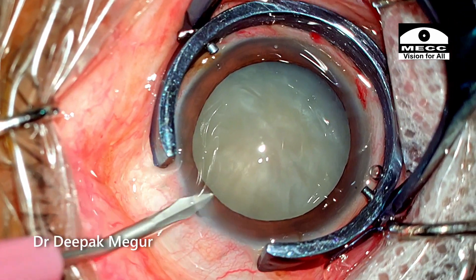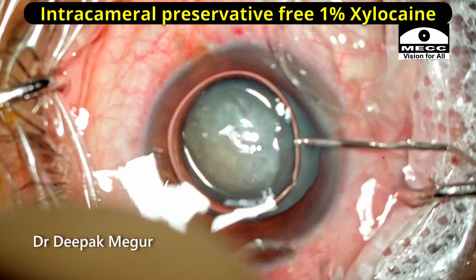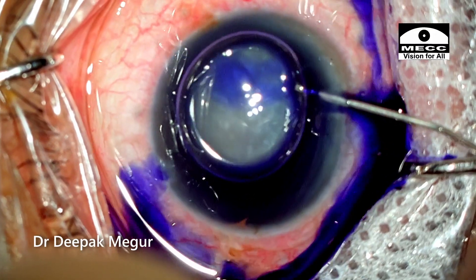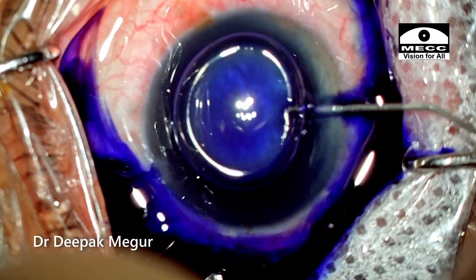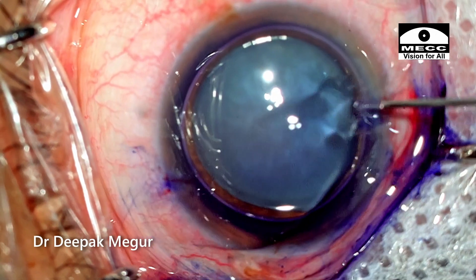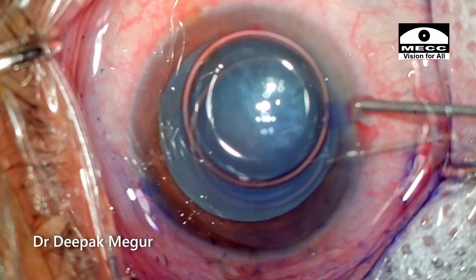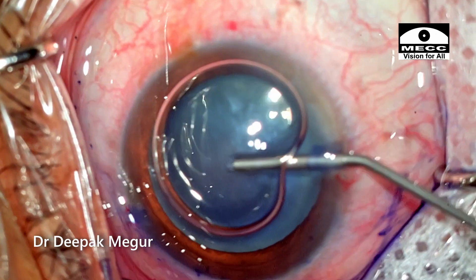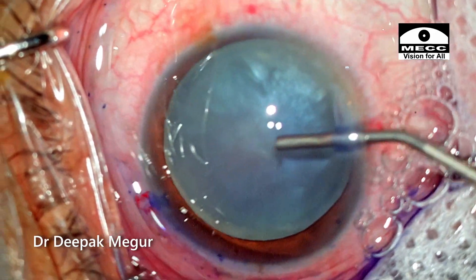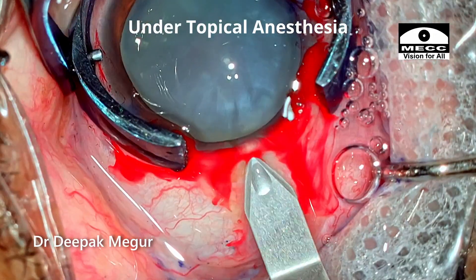The side ports are made and the staining is being done under the air bubble. OVD is injected and I'm planning the main incision. The patient is quite cooperative and this is being performed under topical anesthesia.